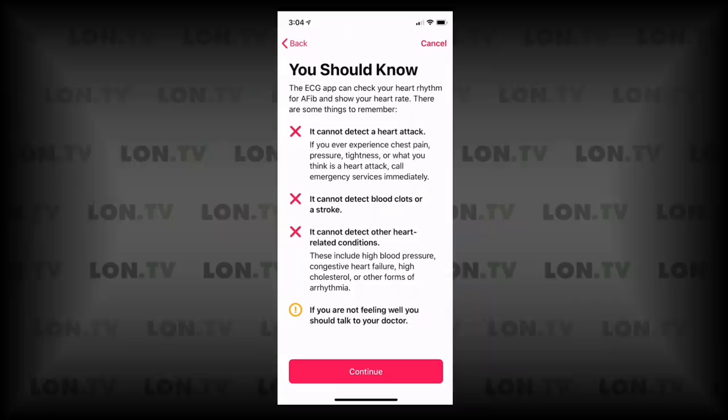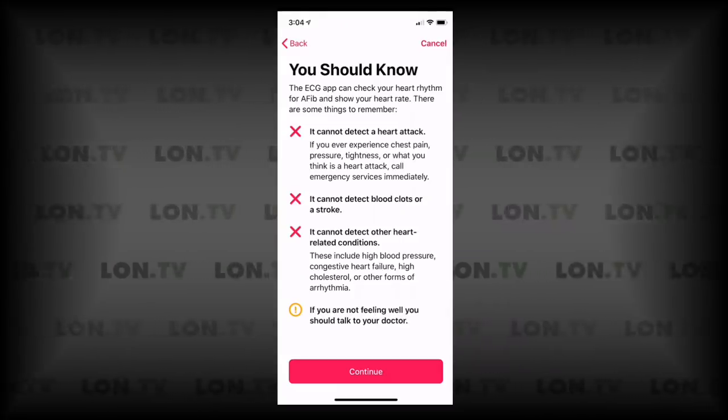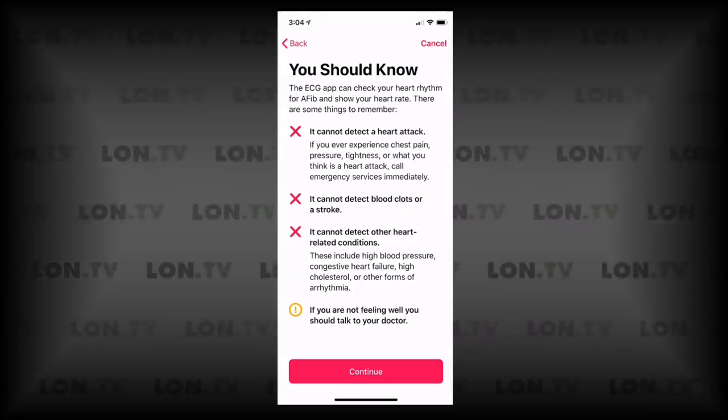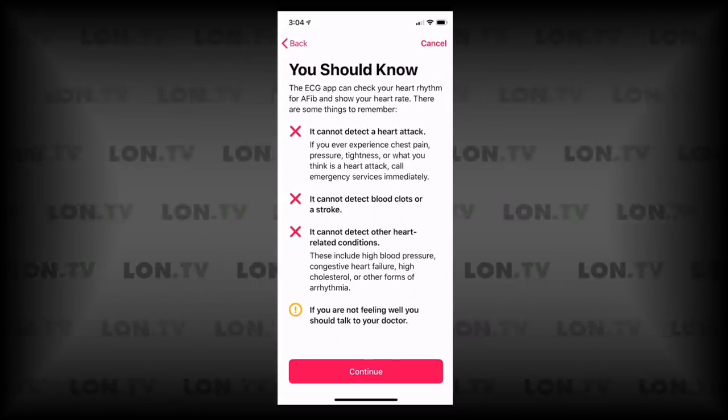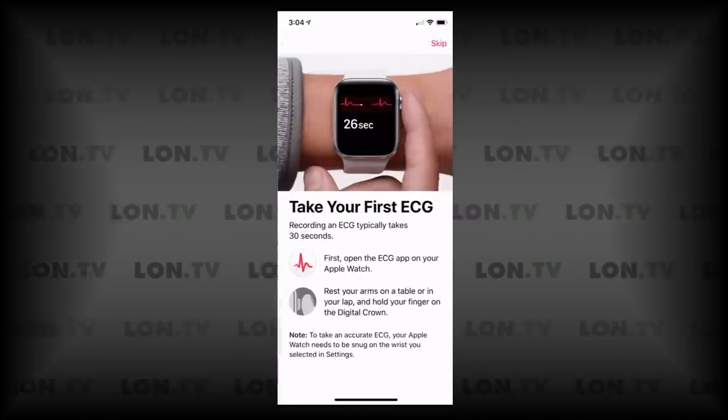Next it looks like we're getting some disclaimers about things it can't detect, including a heart attack, blood clots, a stroke, or other heart-related conditions. So this is specifically an AFib detector and nothing more, and they want to make sure you're aware of that.